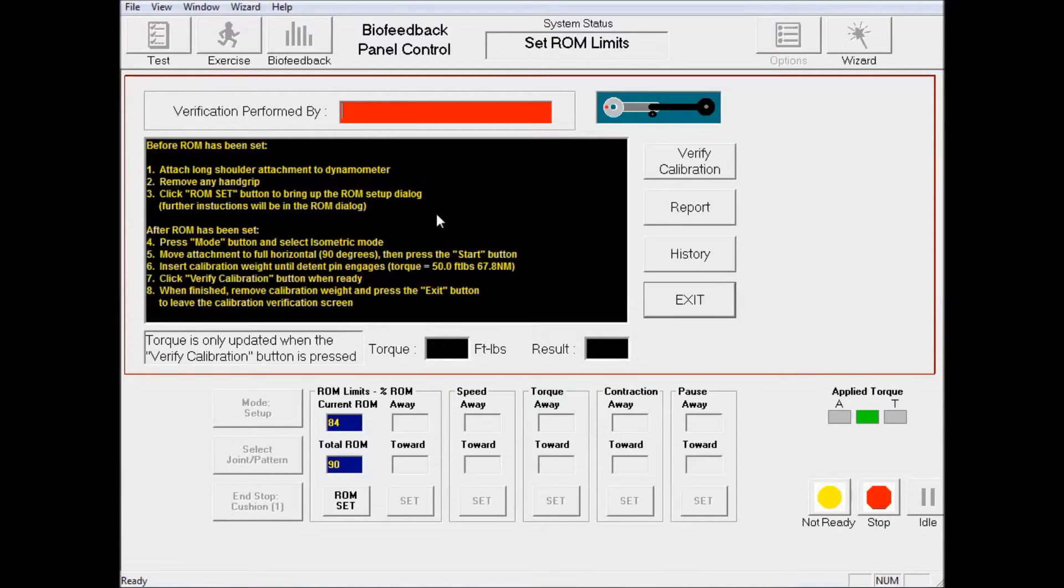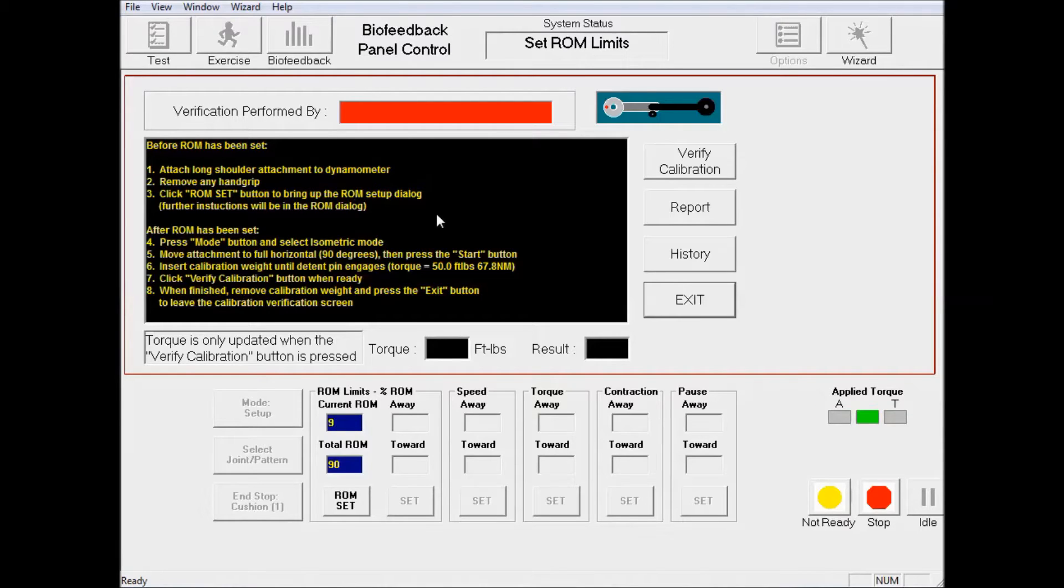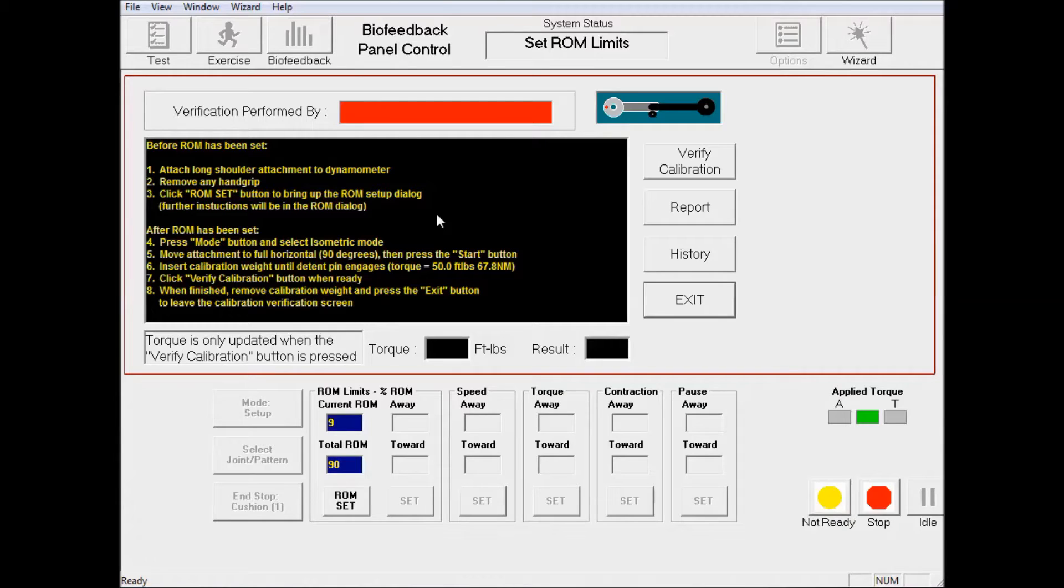The first step is to attach the shoulder attachment to the dynamometer, which I have just done. There should be no hand grips. And then from that point, you're going to click on Range of Motion Set, which is right here.